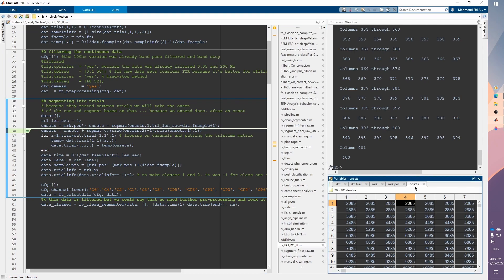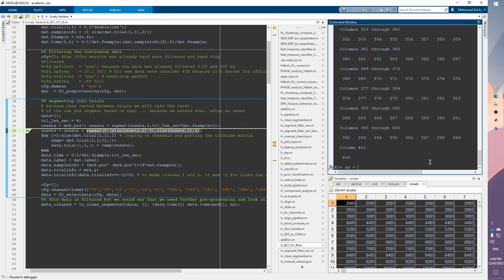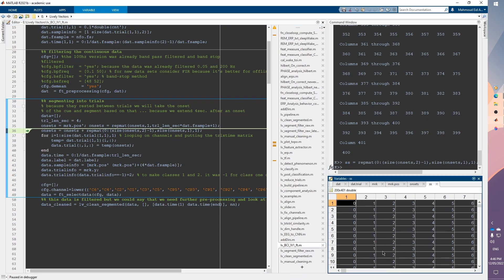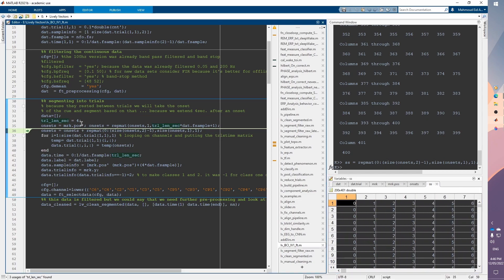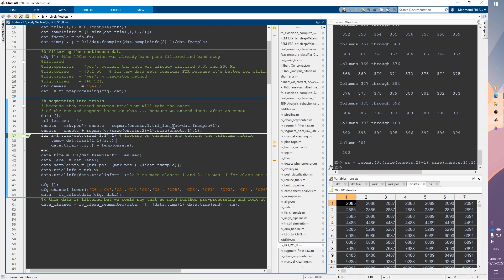I need this matrix of indices to be incrementing because that's the index to access the next sample in sequence. So I create this offset vector and then repeat it in the row dimension. I'm expecting it to go from 0 to 400, repeated across rows — that's what we're creating here. Then I sum this to 'onsets', and when executed we can see that the onset values are now incrementing correctly.